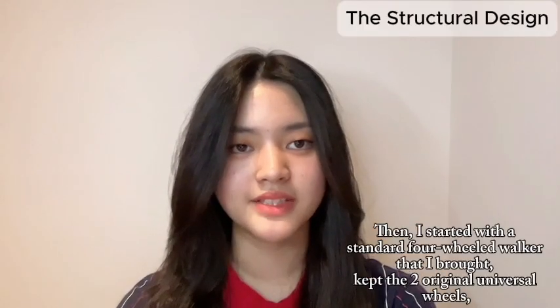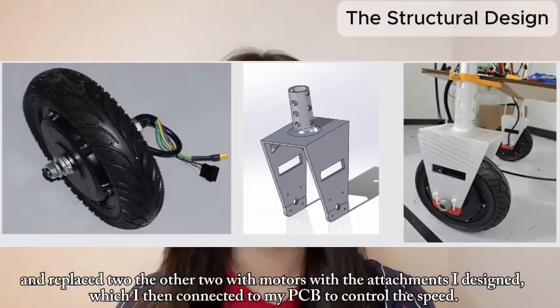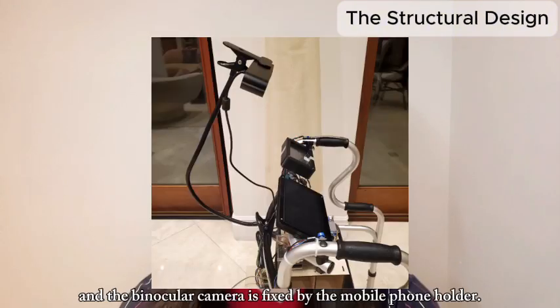Then, I started with a standard 4-wheeled walker that I bought, kept the two original universal wheels, and replaced the other two with motors with the attachments I designed, which I then connected to my PCB to control the speed. The pressure transducer is placed on the right-hand side only so that the user's other hand can do other things, and the binocular camera is fixed by a mobile phone holder.